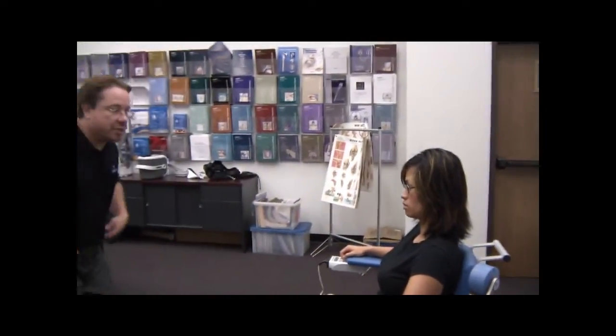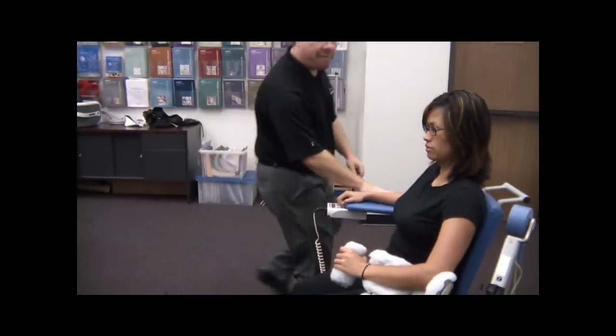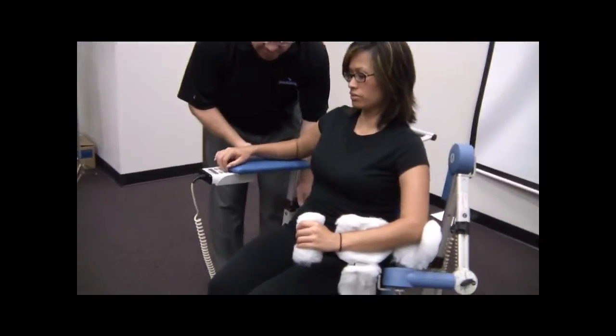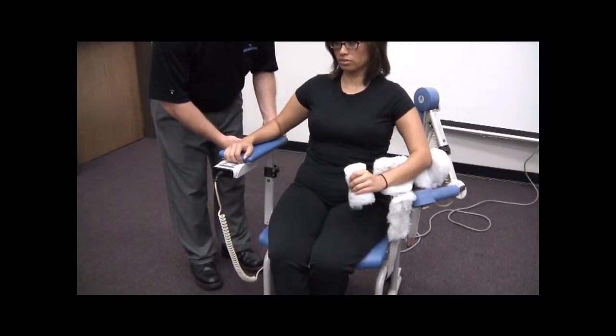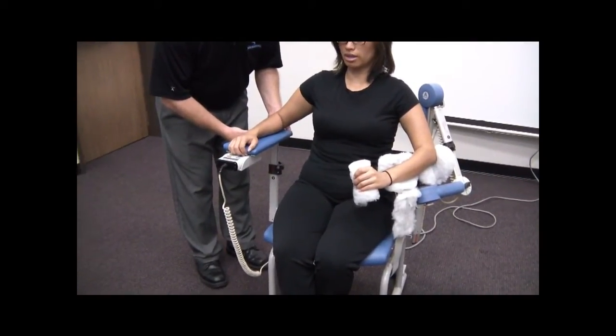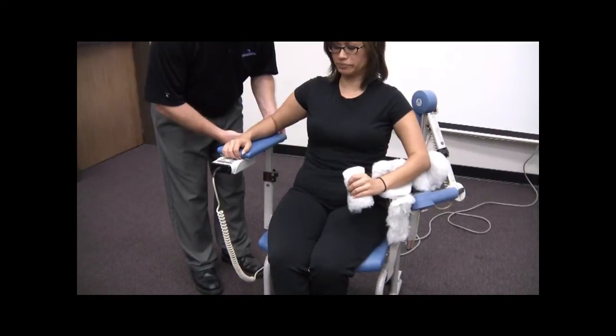So what I'm going to do is come around from the front. I always take a look at the patient to see if they look comfortable and even shouldered, and right now she does not, and part of that is because of the off armrest. So I'm going to put this at a comfortable level for the patient. Is that comfortable, or would you like it a little bit further down, a little further up? A little bit further up. A little further up, right there.